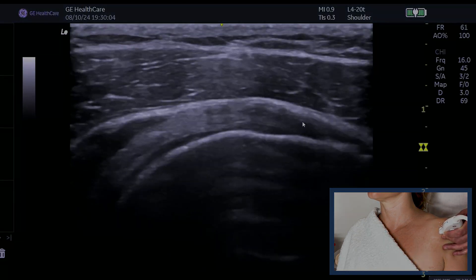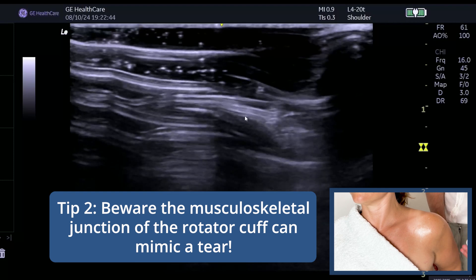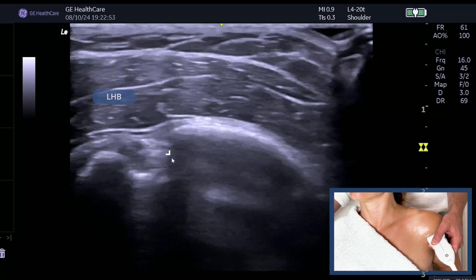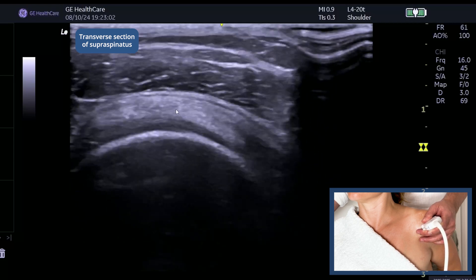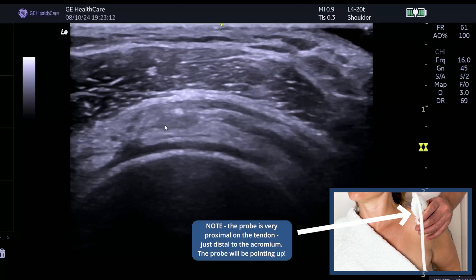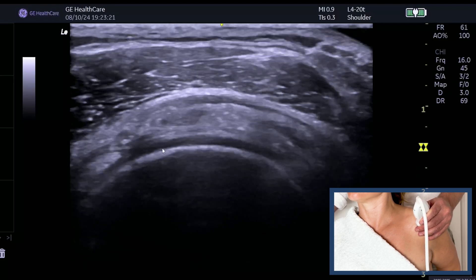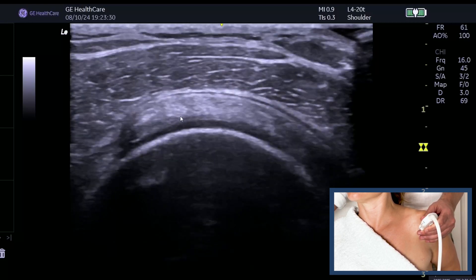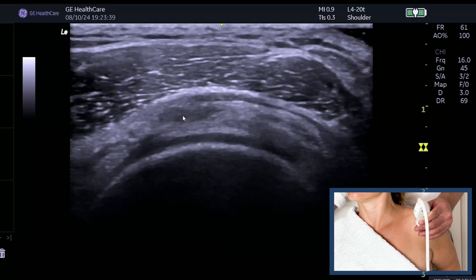When you're scanning something round, you must do lots of heel and toe to ensure the beam is perpendicular. Now I'm going to show you a pitfall — this can happen in any rotator cuff, but normally it happens in supraspinatus, particularly when you really stretch out the tendon. First of all, we find the biceps — we always go to our biceps, that's our friend. Now we come around laterally to look at supraspinatus and see the greater tuberosity. As we go into the proximal aspect of the tendon, can you see this dark hypoechoic region? Some people show me images thinking this might be a tear, and you can also see a darker patch here, but this is the musculotendinous junction of supraspinatus.